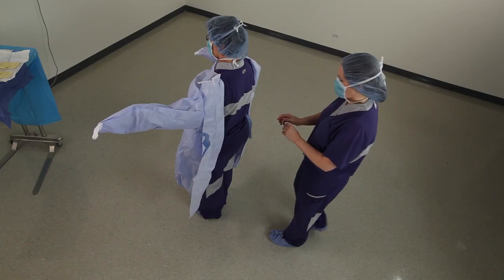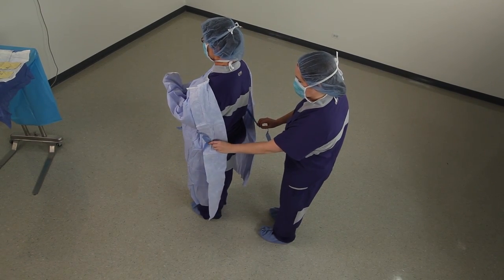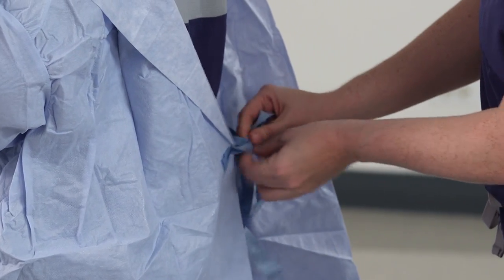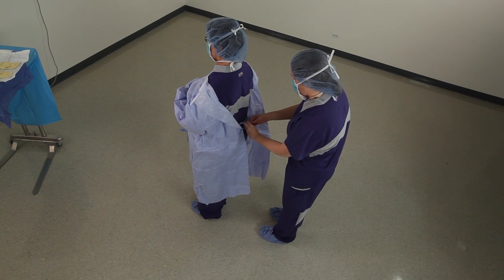Slide arms into sleeves as far as possible without compromising sterile technique. The individual donning the gown should be assisted by a second clinician, who should ensure adequate fit by pulling the gown over the shoulders.